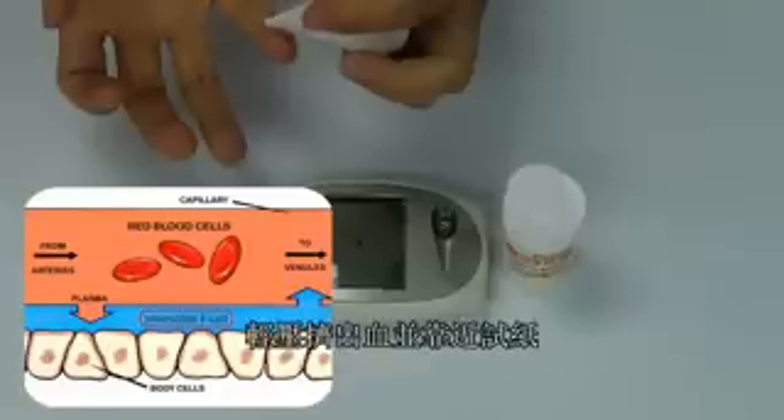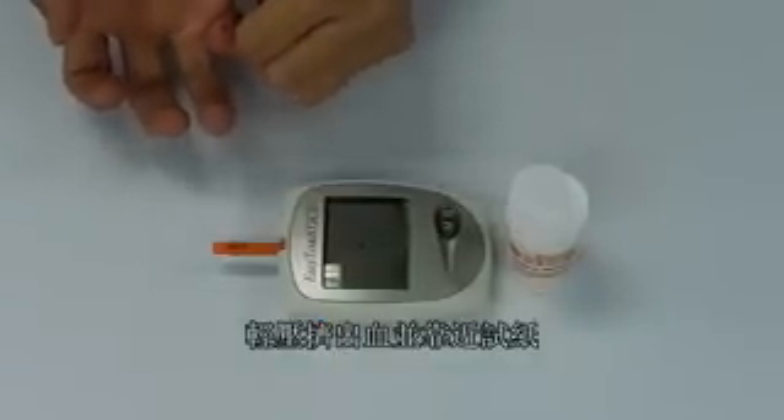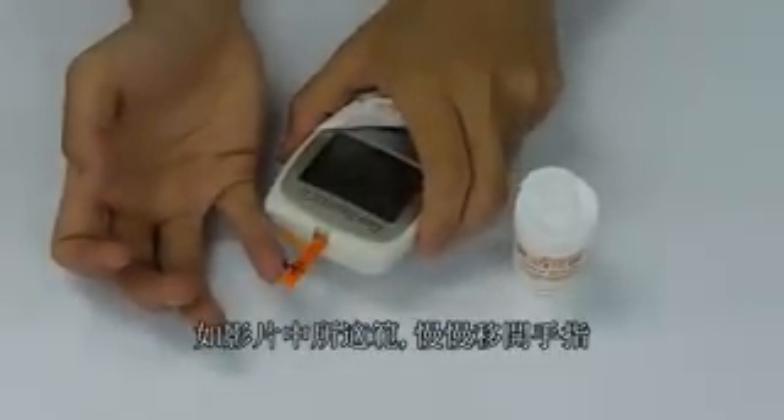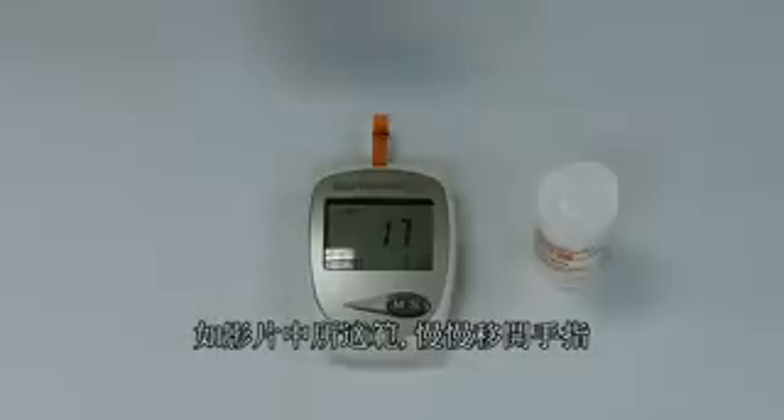With moderate pressure, squeeze out a second drop large enough to perform the test. Once the reaction zone is full, move your finger away laterally to the direction that the blood is applied, as shown here.